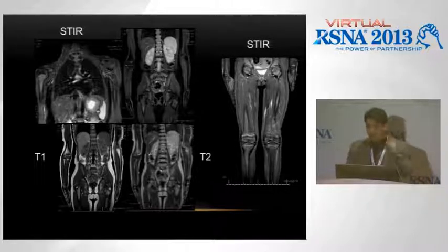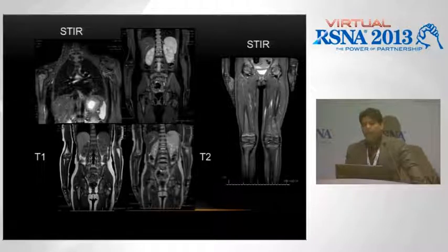Yet in the 14-odd Li-Fraumeni patients that we have scanned, we've had one positive case where there was a lesion in the proximal humerus that was biopsied and came back as a simple bone cyst. So we don't have a true positive case yet, but that's something that's recommended for screening in this set of complex patients.